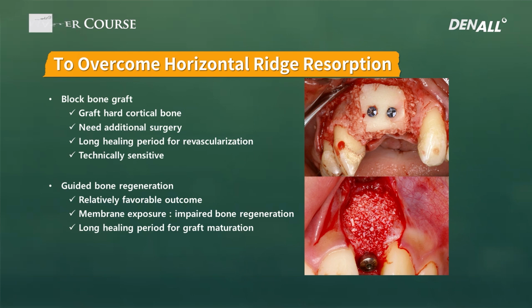There are ways to regenerate buccal bone. Buccal bone is more problematic in most cases, so you can do block bone graft. The downside is that additional surgery is necessary, and for revascularization, a long healing period is necessary, and it's quite technically sensitive.